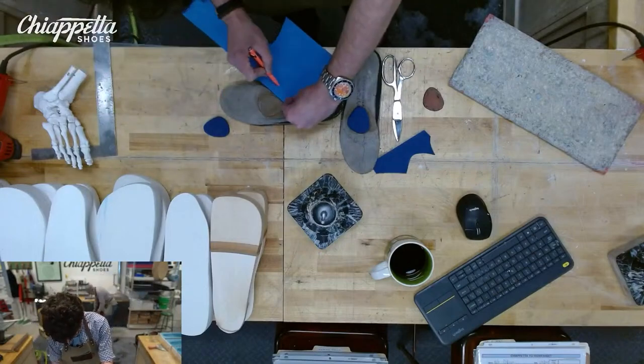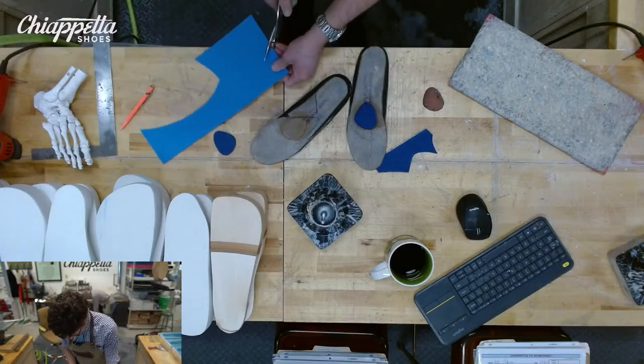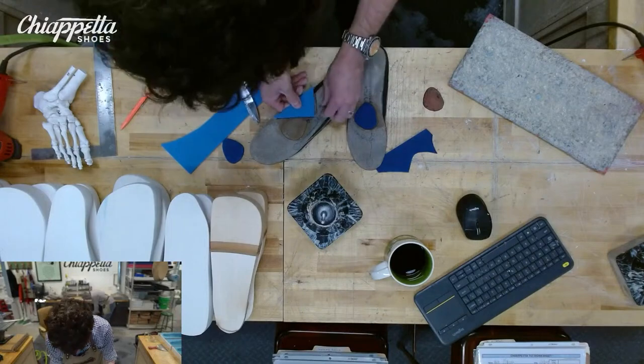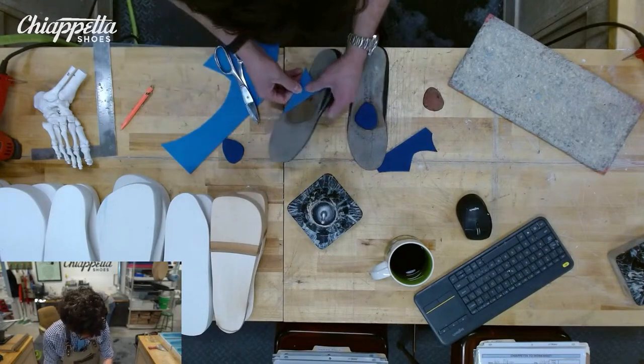Yes. All right. So with this scaphoid pad, we're not going to wrap up against the side. It's not about wall control. I'm not worried about the foot collapsing in. It's just that foot needs a little extra loving.